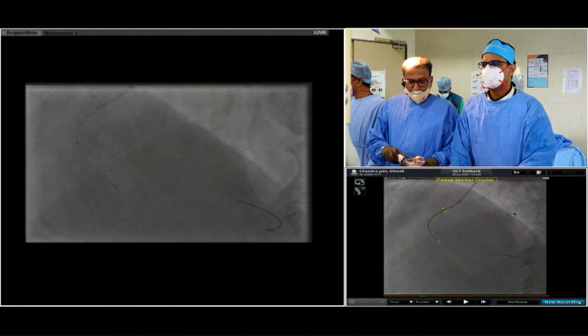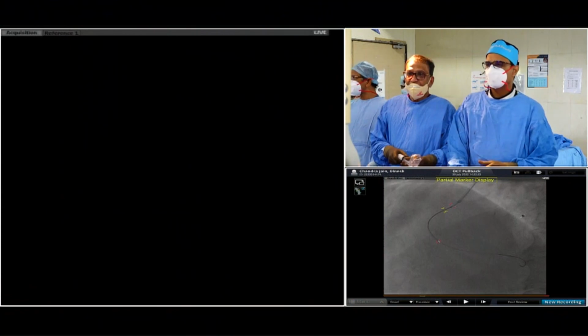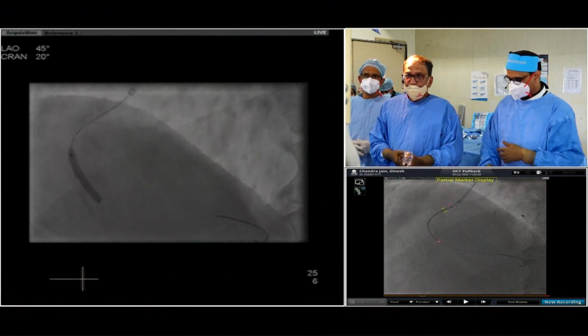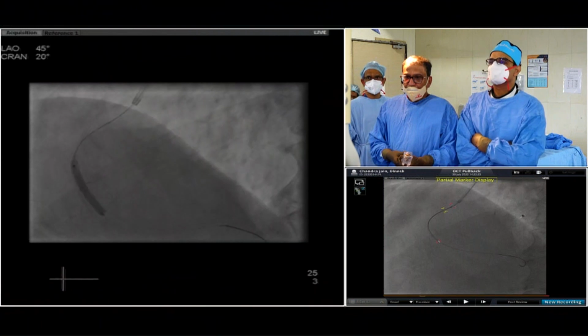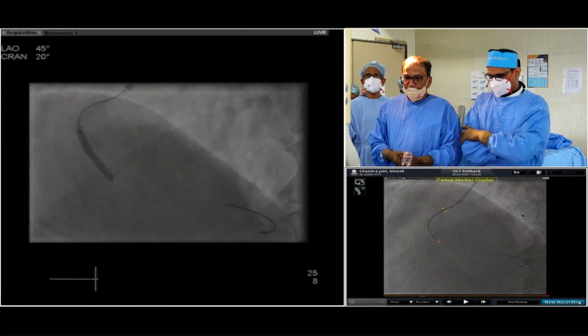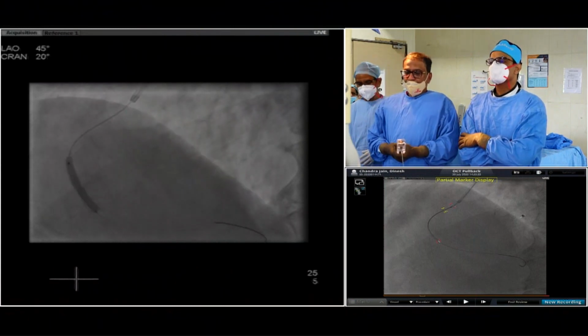Yeah, we'll just go to 10. 10 nominal, no? Yeah. We'll stay at 20 seconds for this. Can you maybe explain how exact the placement will be using this method? Maybe your mismatch will be 1 or 2 millimeters or less?